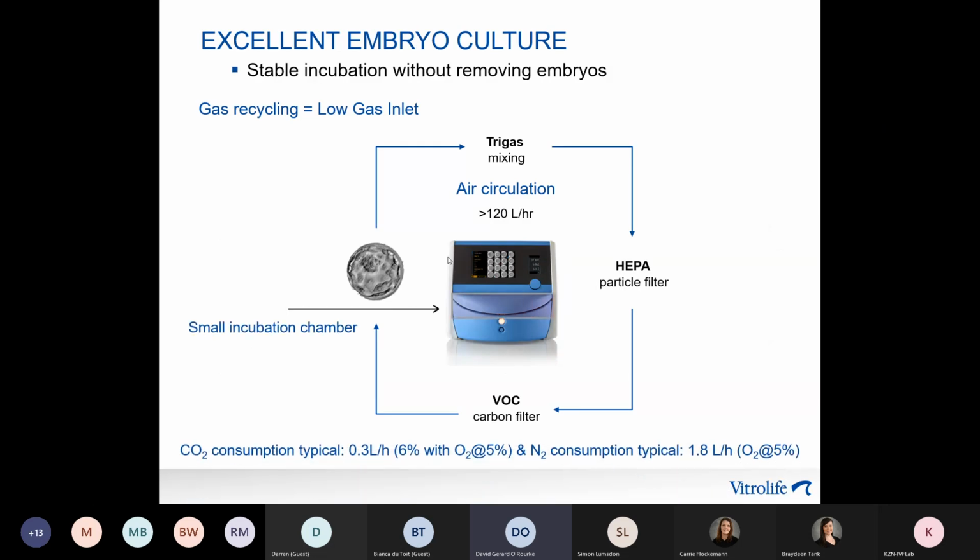Now, a number of you have said that you use time-lapse. I think it's a really key part of the biopsy procedure, as it allows you to look at the embryos through their developmental process and select embryos when they're ready for biopsy. So if they are either fully expanded, if that's when you choose to do your biopsy, or when the trophectoderm has herniated sufficiently from the zona.